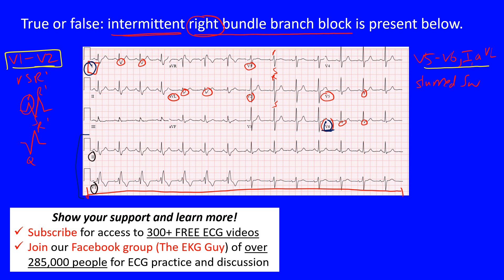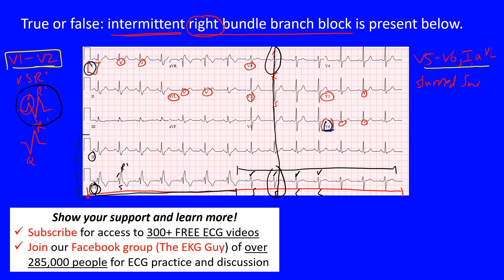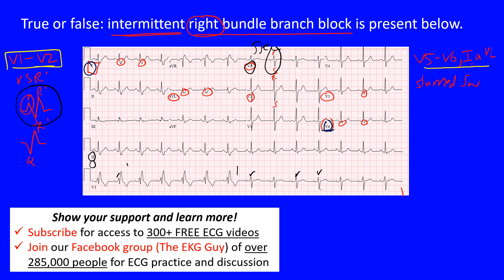Looking at the rhythm strips at the bottom - V1 and V2 - notice that these complexes from here to here are different from those that follow. We have RSR prime complexes, which we said we may see in right bundle branch block, but as you continue through you start to see RS complexes. Things have a temporal relationship on the ECG, meaning this RS complex here is the same one we see in the main V1 lead further along.